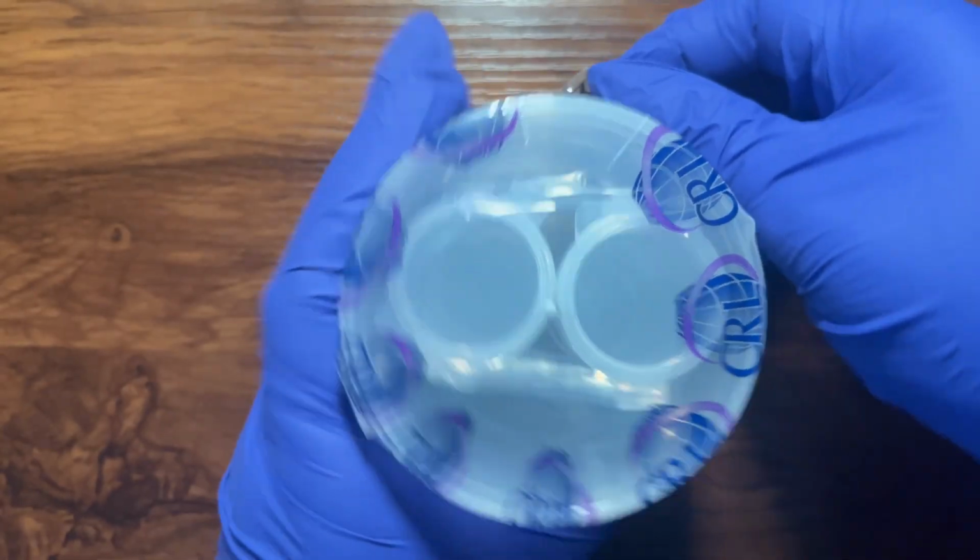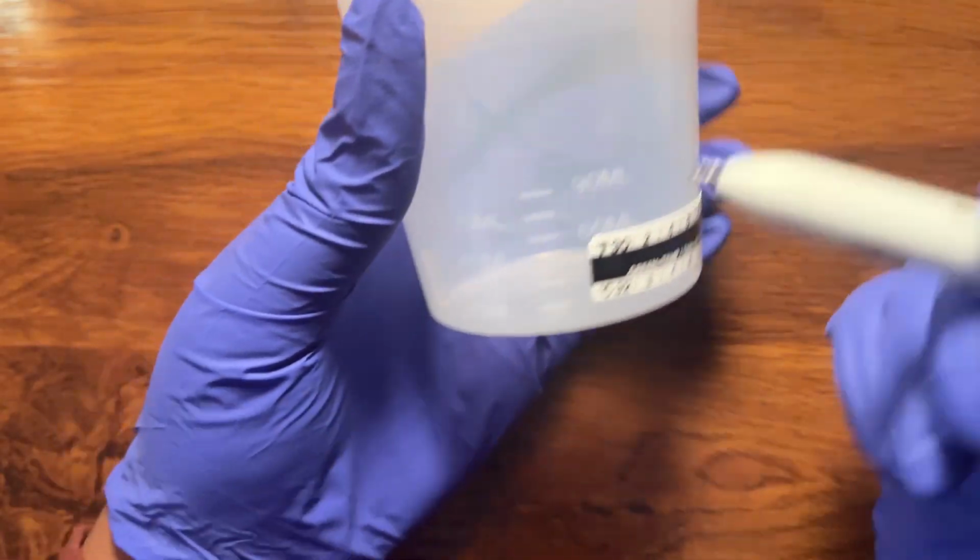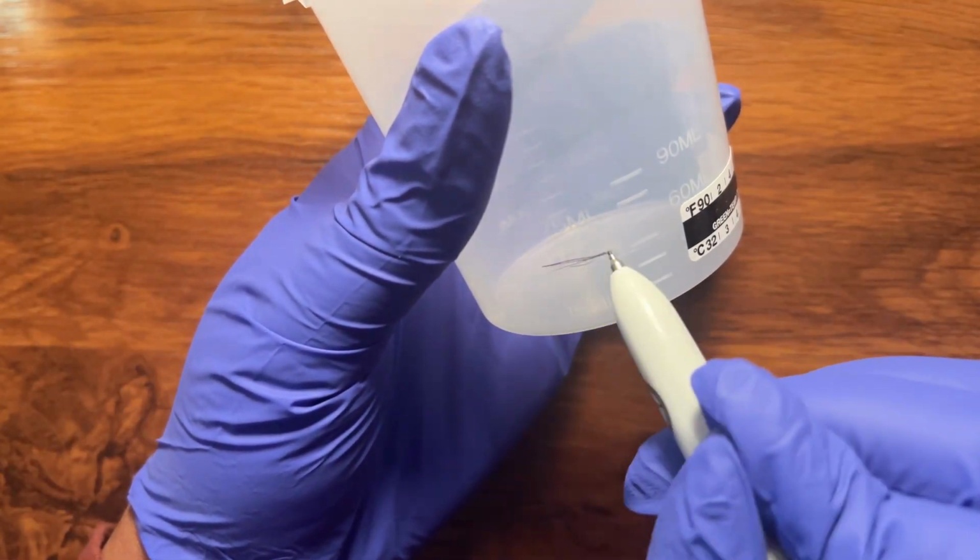It's a typical day at your collection facility. A donor comes in, you hand them the cup, tell them you need 45 milliliters of urine into the cup. Do not flush the toilet during the collection, and do not try to wash their hands, and for them to just bring it out when they're finished. So they go in, do their business, and they come out with this: a specimen that does not have a valid temperature between 90 and 100.